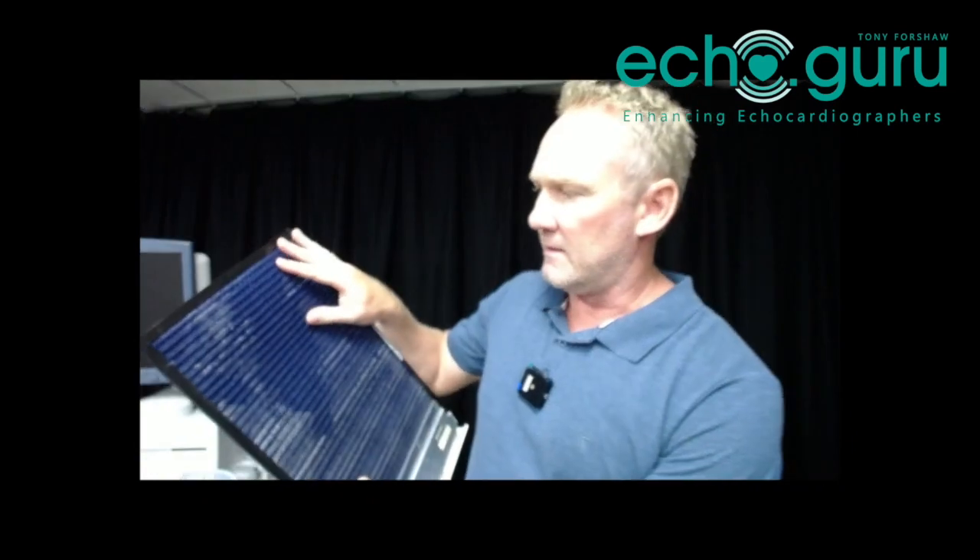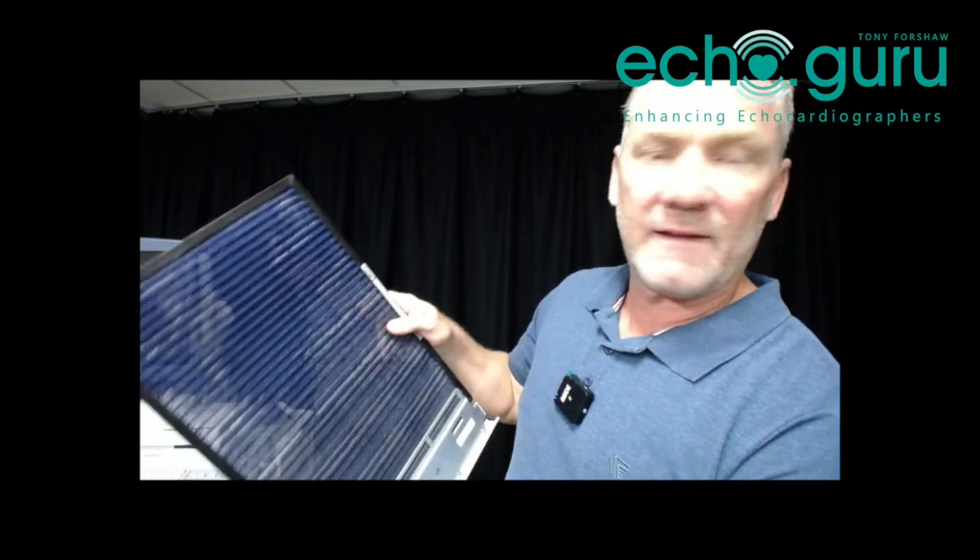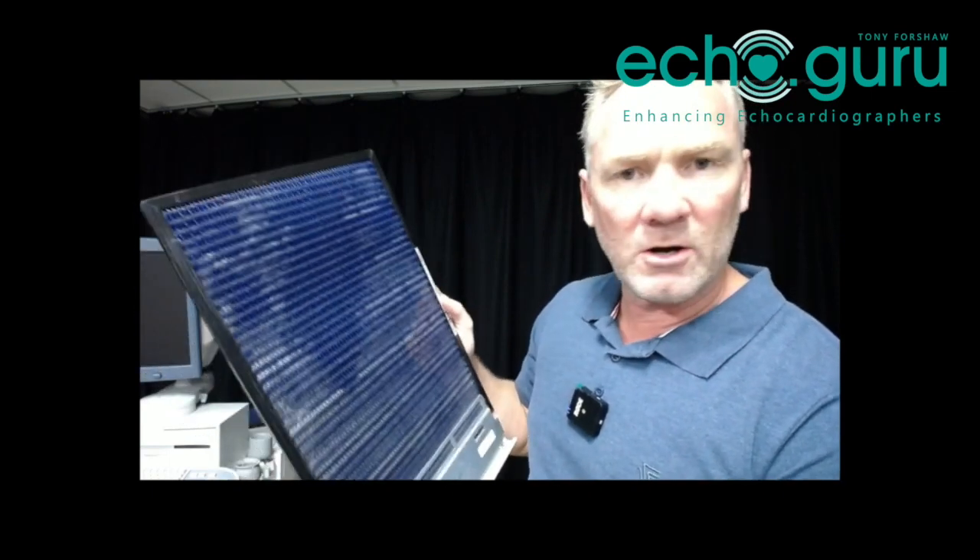I've given this a wash — run a vacuum over it and washed it under the tap with some running water. I'm going to let that dry a little bit. To be honest, not a lot of dust came out of this; it was pretty clean to start with. That's a good sign — it means somebody's been maintaining the machine and it's been looked after. We'll let it dry and pop it back in once it's all dry.